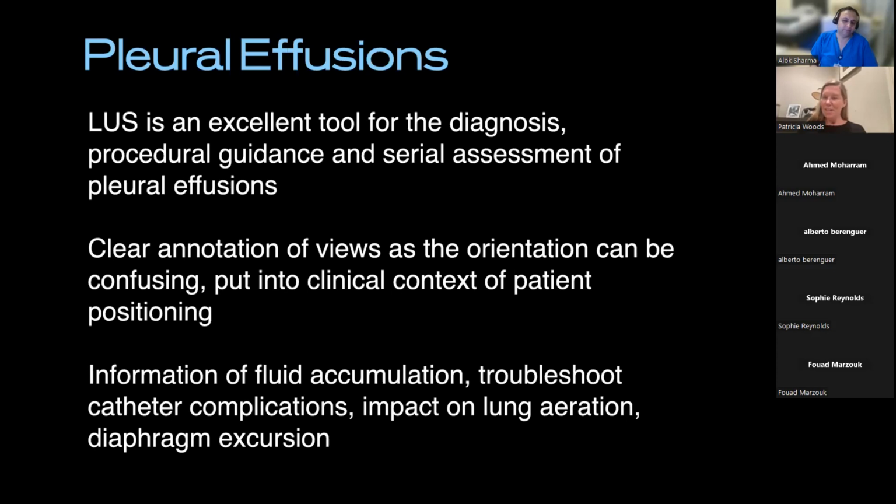I've never really done that. I know there are clever calculations of estimation of volume and 3D structures, and I'm aware of the work in adult ICU. I don't do that. I will often translate that to colleagues by just how many millimeters I'm observing from the chest wall in inspiration, expiration, like the diagram. So I don't actually do any clever maths and say the volume is X, Y, Z. Sometimes you'll get that when you're draining it. But I think you have to put it in context.